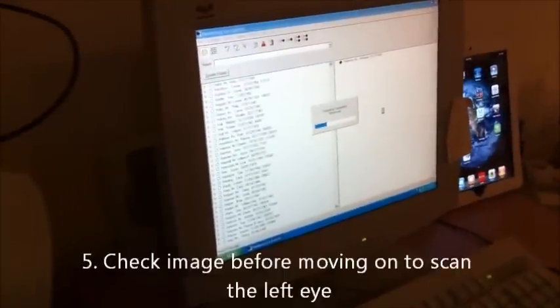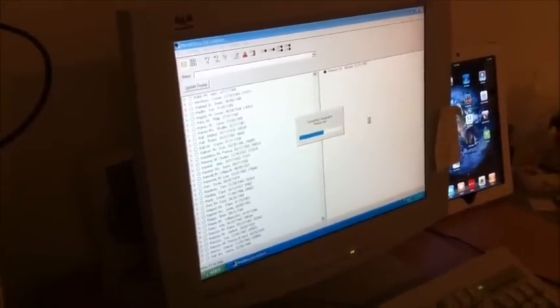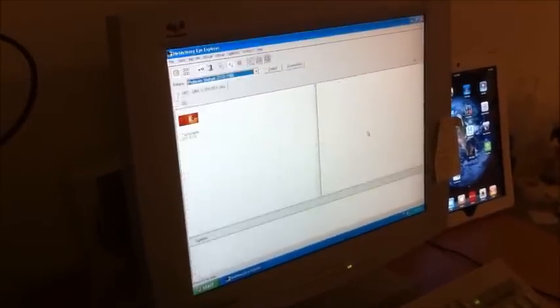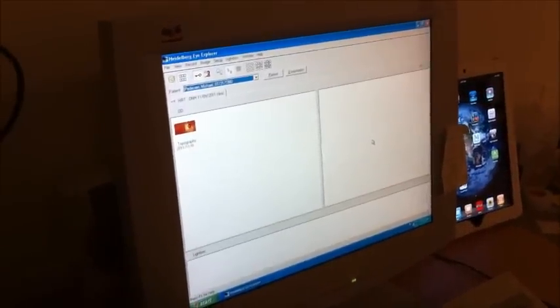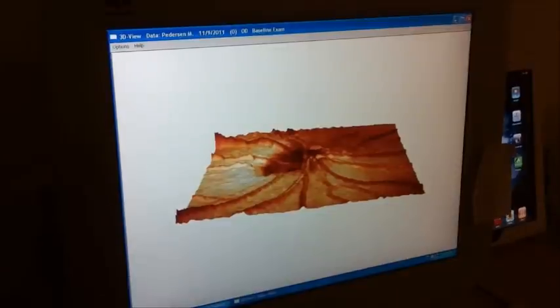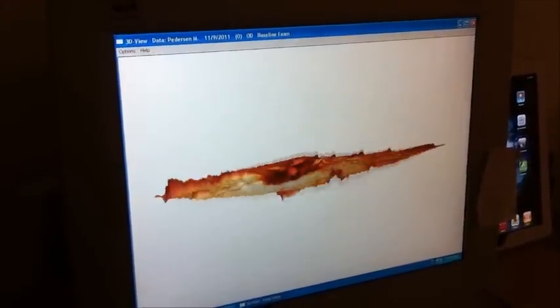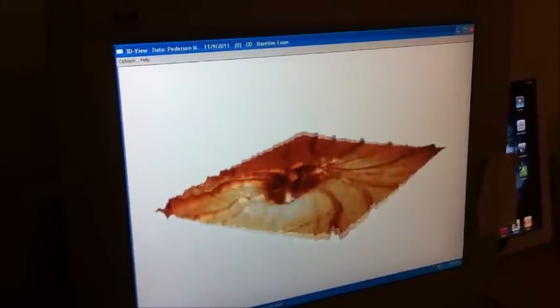Have a seat back. We're going to save that eye and save the topography on the right eye. I like to have a peek at the image before we swap over to the other eye so we don't have to set everything up again. We'll wait for the calculations. It takes a moment, but it's pretty neat — once it generates the picture, it takes about 64 scans depth-wise, kind of like a deck of cards. You can click on the 3D rendering option and actually rotate the nerve, viewing it from any angle. It's a neat tool to show the patient from a counseling standpoint.